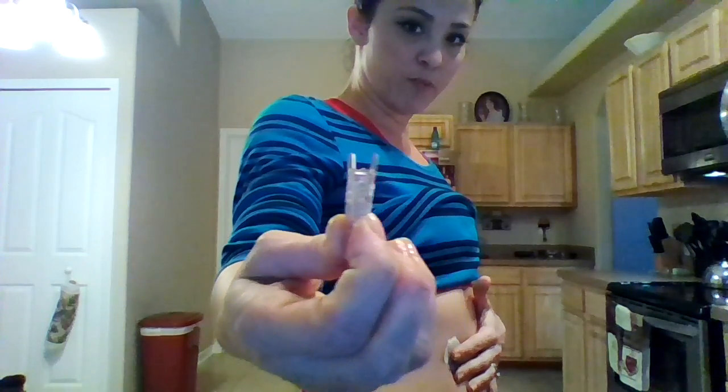You can't see the needle from here because when you do that, the needle retracts back down into the needle housing, which makes it kind of neat. I usually still stick them in a sharps container just because it's a needle, but I guess it's probably not necessary because you can't get to the needle unless you, I don't know, take it apart. I don't know who would do that, but whatever.